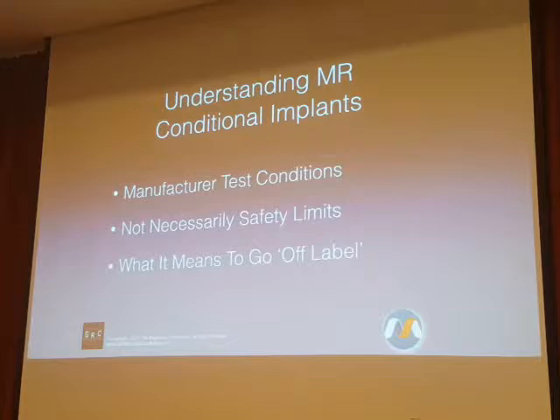So they purposefully downgraded the labeling to make sure that people didn't push the envelope, that they didn't do something that, in theory, at least to the attorneys, might expose the implant device company to some greater liability.